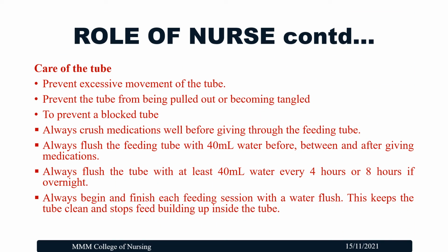The next role of the nurse involves the care of the tube. Here, the nurse should see that excessive movement of the tube is prevented, prevent the tube from being pulled out or becoming tangled, and try to prevent a blocked tube. Always crush the medicines well before giving through the feeding tube.